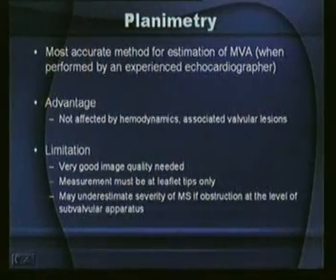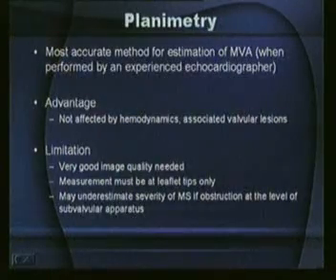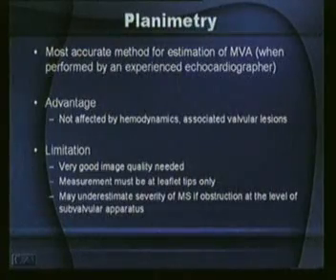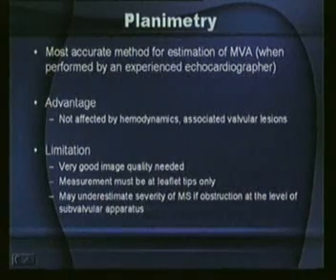Now the bottom line here is when performed by an experienced echocardiographer. That's important, because if you have cut the mitral valve at a tangential angle, you will get an abnormal report. It has to be at the tips. It has to be well defined. Only then will you freeze frame it and planimeter it, and we'll show you how. Advantage, the valve area is not affected by hemodynamics. Whether the patient has an associated AR or he has an AS, it doesn't matter. Your valve area will be valve area.